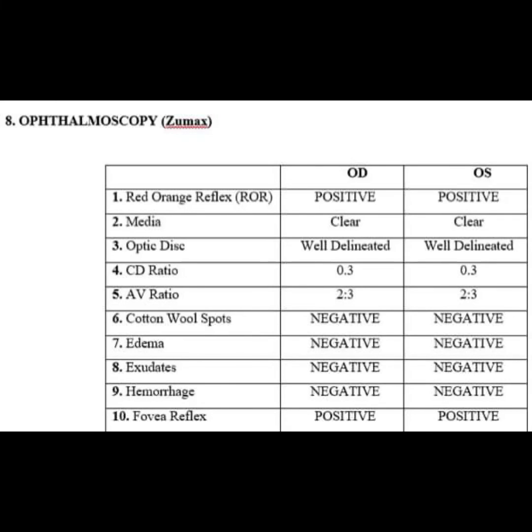First, red-orange reflex, OD, OS positive. Second, media, OD, OS clear. Third, optic disc, OD, OS well delineated. Fourth, CD ratio, OD, OS 0.3. Fifth, AV ratio, OD, OS 2:3.